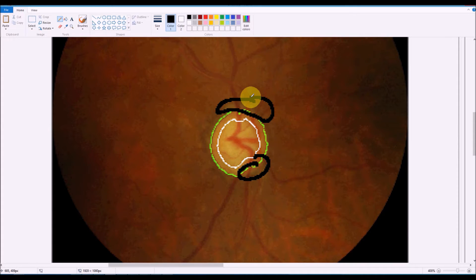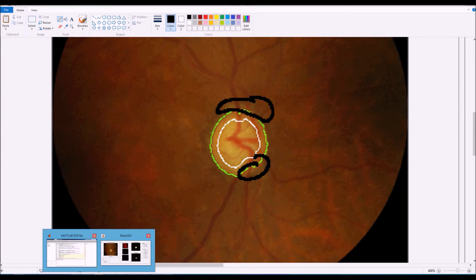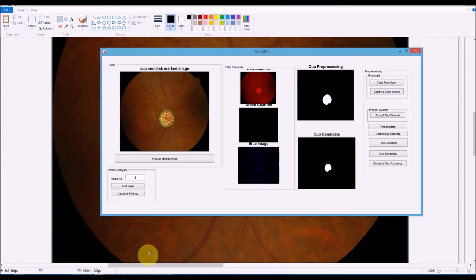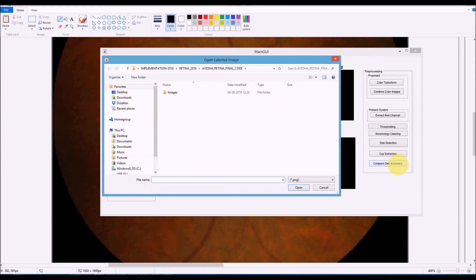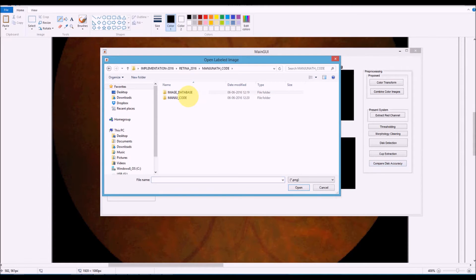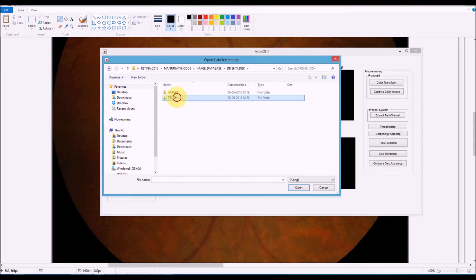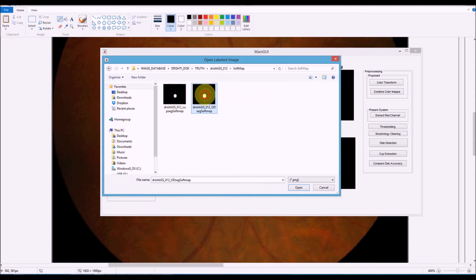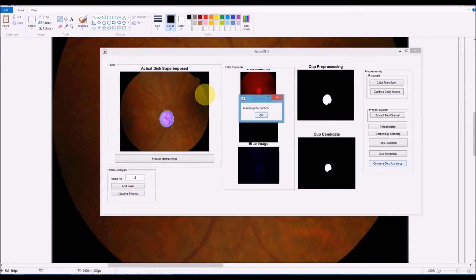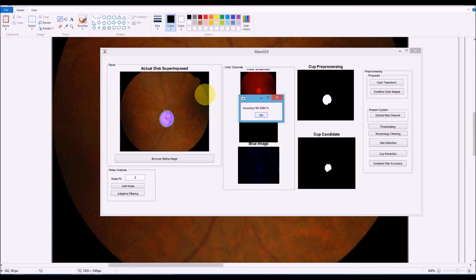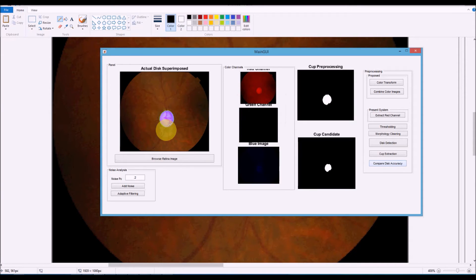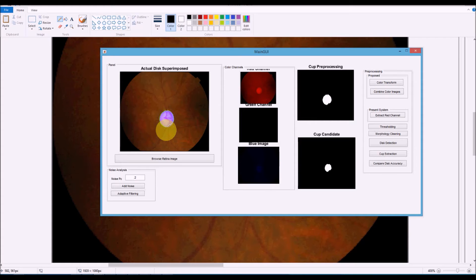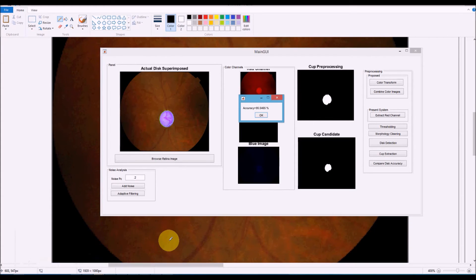When you take the accuracy of this method, compared disk accuracy, go for the truth image. You can see the accuracy is about 95.54 percent, which can also be seen from this area. You can see a lot of the violet color is being left out.